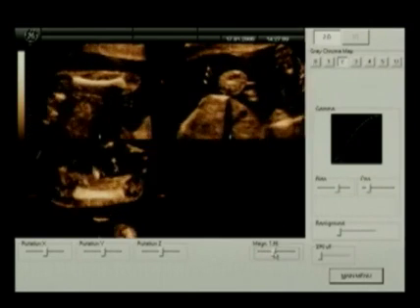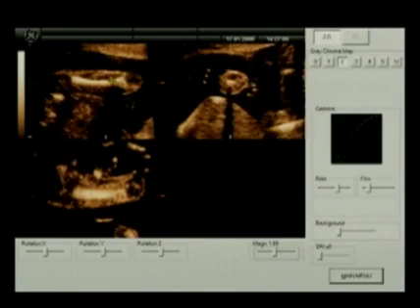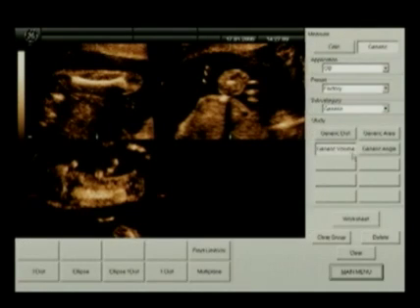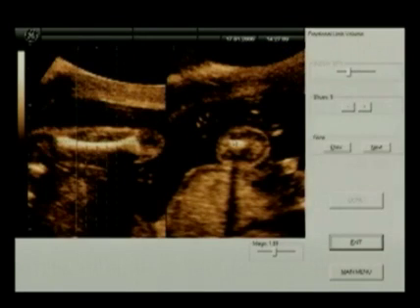These are orthogonal multiplanar images, and you can see I can just magnify the thigh, and I can look back and forth, move the plane back and forth to look at the axial views of the soft tissue on the right, and then the next thing I would do is use the measurement tool, fractional limb volume, right there, and essentially take a measurement of the femoral diaphysis length from one end to the other end, at which time the computer, and this is 4D View software from GE Healthcare, you can actually take five manual traces of the subvolume that's defined by the computer.